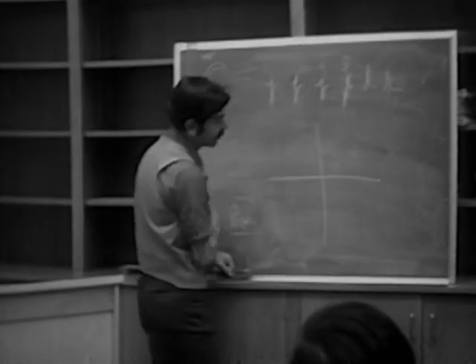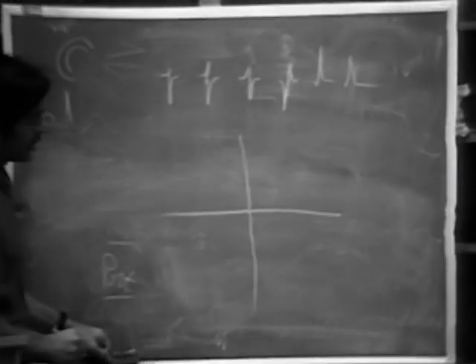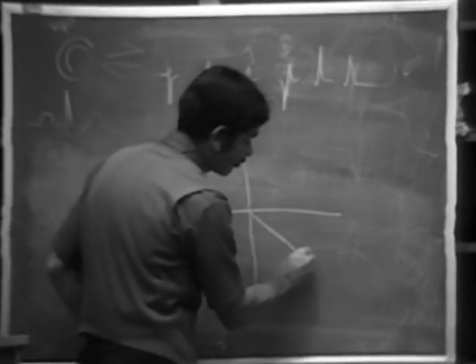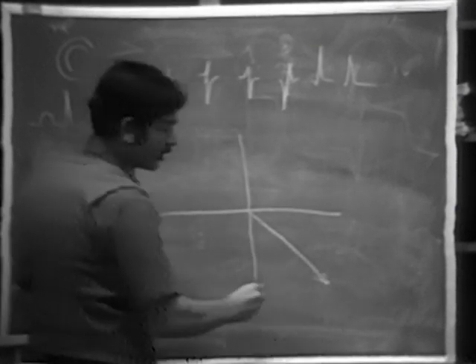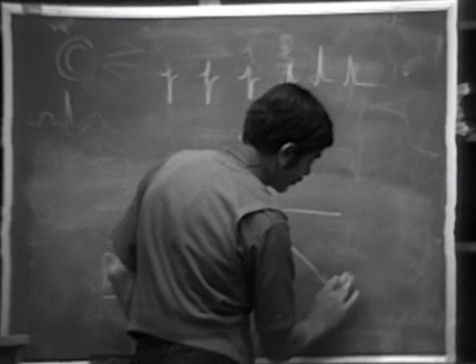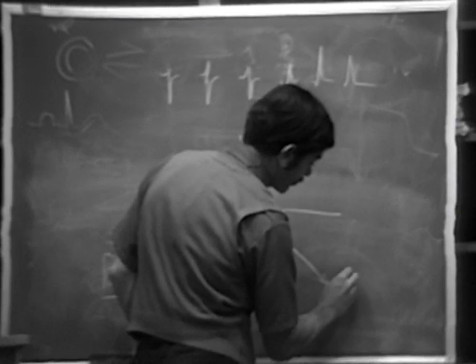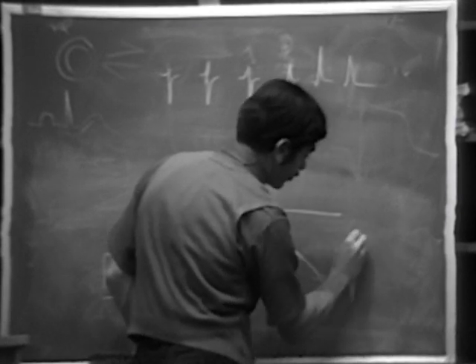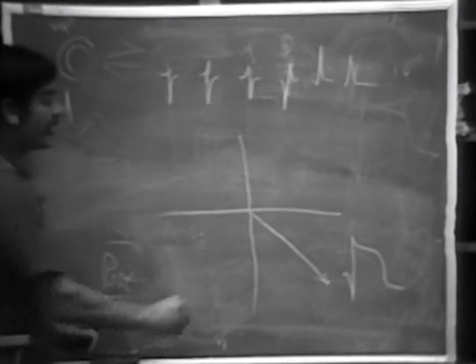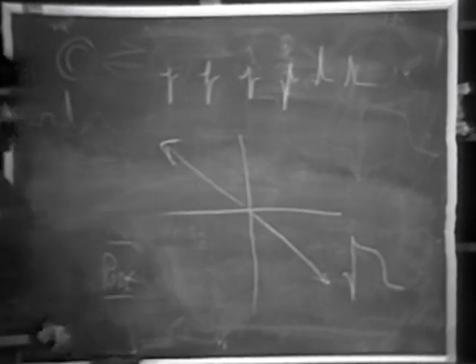Let's say, for instance, that you're looking at the vector system in the frontal plane, right? And this is lead 2 going down this way. And lead 2 looks like this. Let's say you have an infarct pattern in lead 2. Looks like that. What would you expect to see in AVR coming up this way, approximately in that direction?